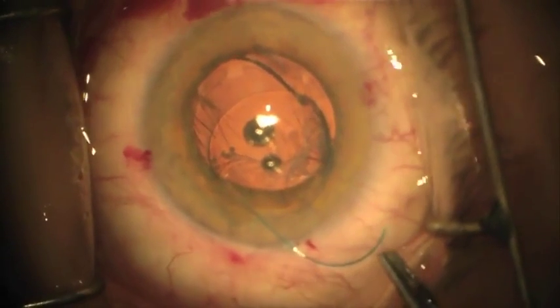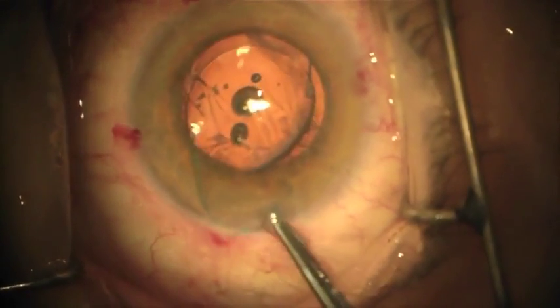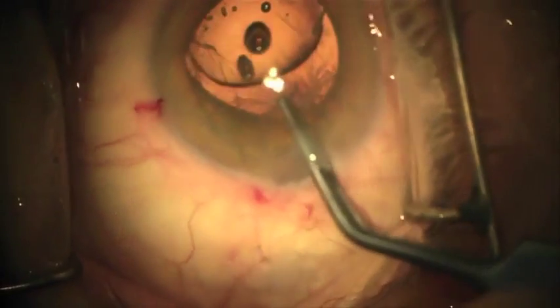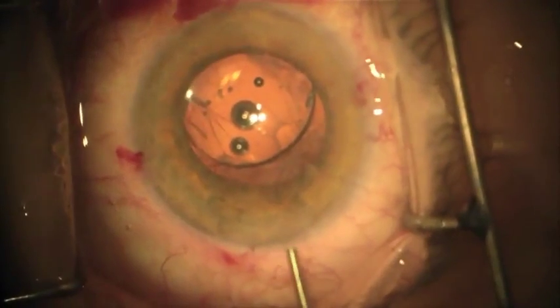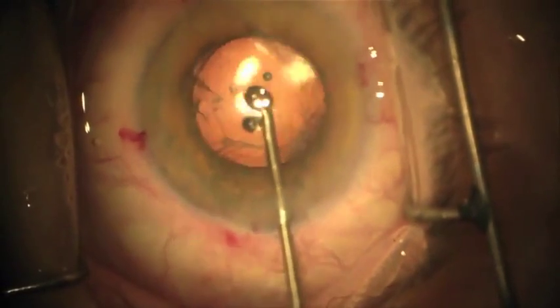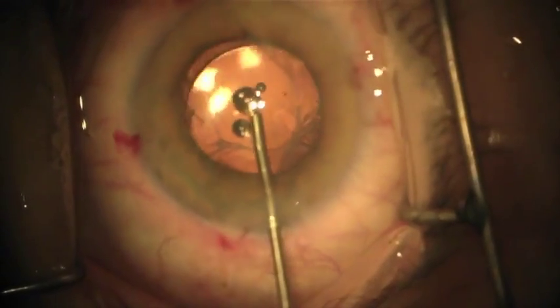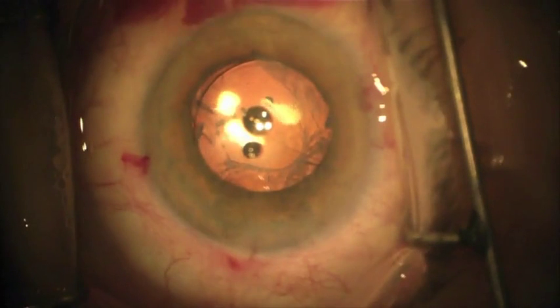Finally, place the trailing haptic in the sulcus either with a lens forcep or with a Sinski hook. Alternatively, you can dial the lens around and guide the trailing haptic into the sulcus. If one desires to perform optic capture, it can be done at this point. Finally, viscoelastic will be removed with the irrigation aspiration handpiece.